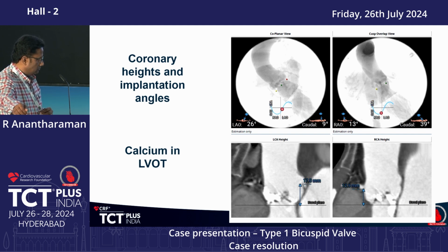When do I stop inflating for balloon expandable? Self-expanding, the PVL, do I post-dilate? How bad is the PVL? What is the risk-benefit? And TEE guidance is going to help you. So if this patient can get a TEE, I personally would advocate, because the imaging information you get is, in my mind, really helpful for decision-making. So absolutely. In the United States, there's been a shift.